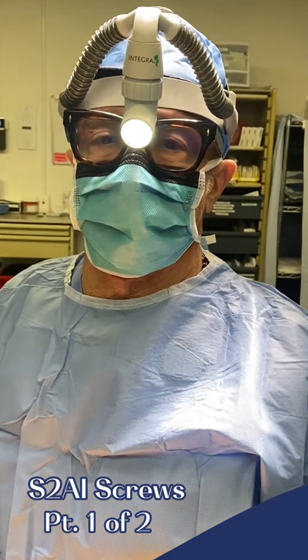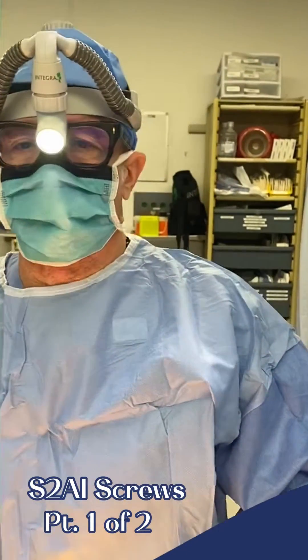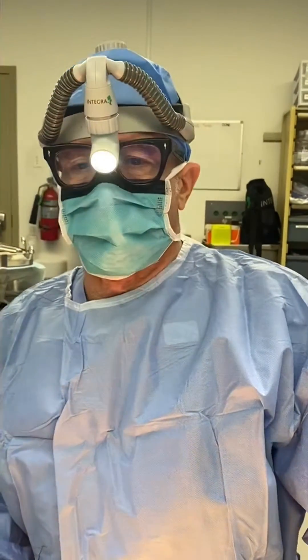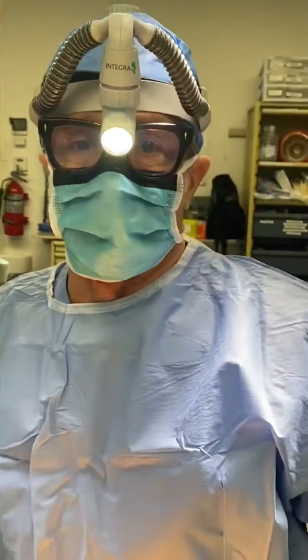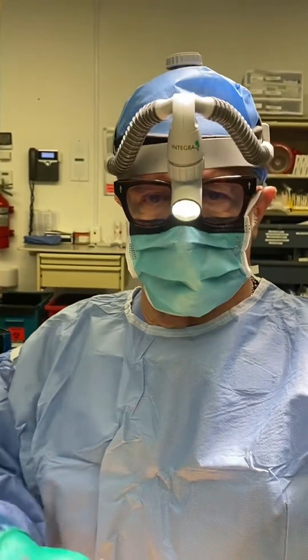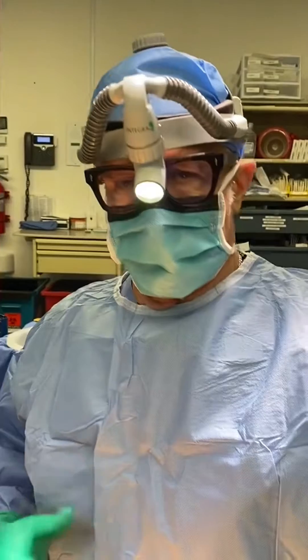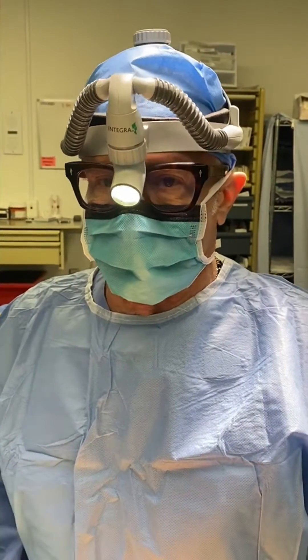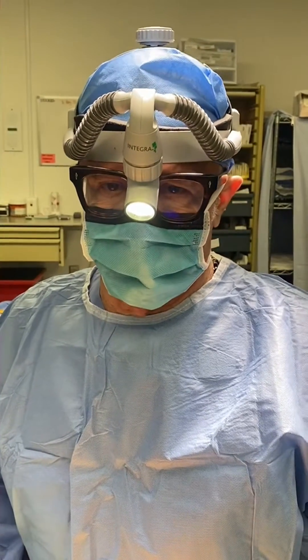Good morning. We're performing a complex spinal operation this morning. This is a patient who's had a previous lumbosacral fusion, done both anteriorly and posteriorly — meaning through the abdomen and also from a posterior incision in the back — and unfortunately the bottom level, L5S1, did not fuse.